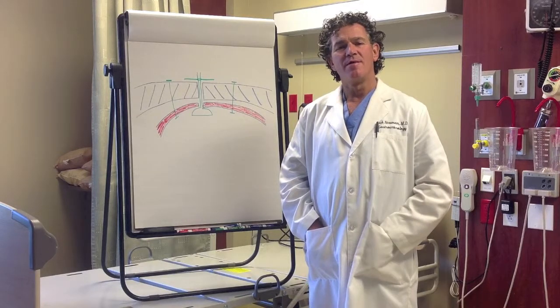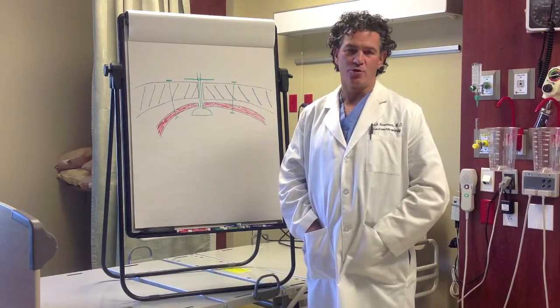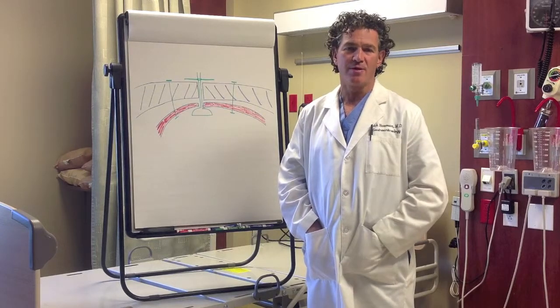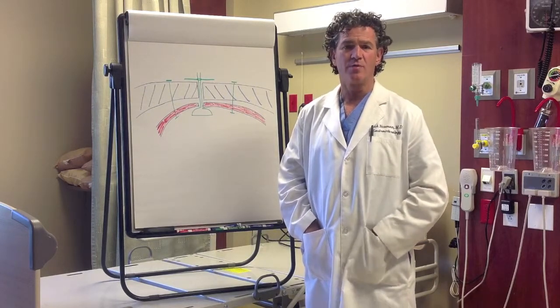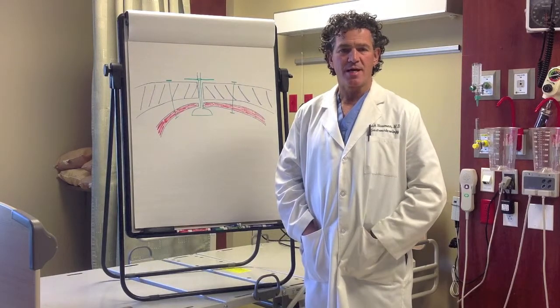I want to make this video to help care for feeding tubes, both nasal type feeding tubes and feeding tubes that go directly through the skin into the body. I'm going to cover several different types of feeding tubes.